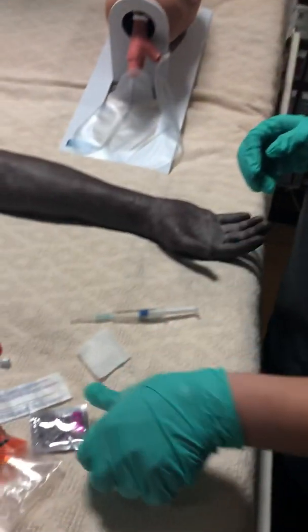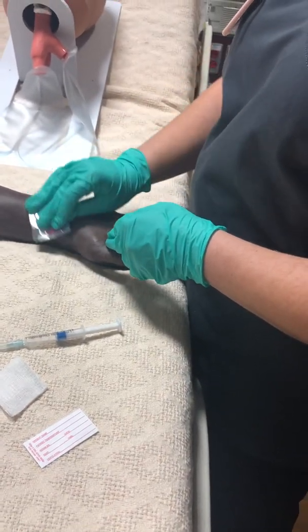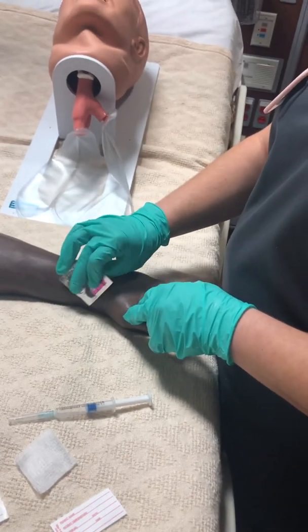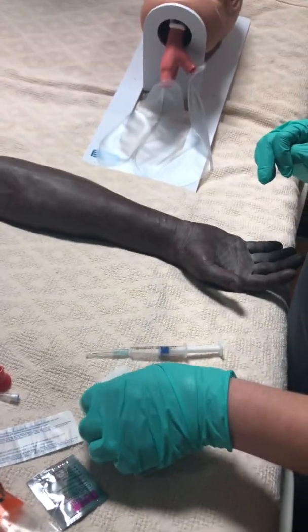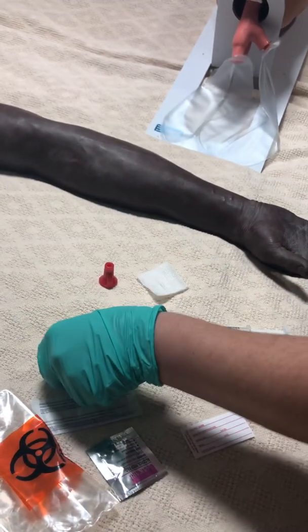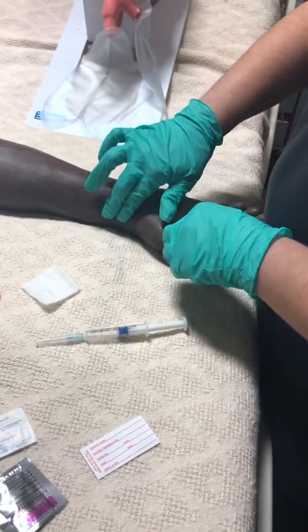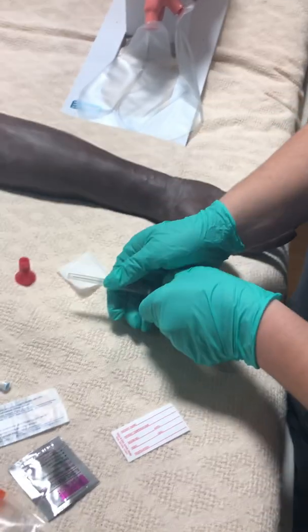When I'm ready, I take my alcohol prep wipe and wipe around where I'm going to puncture the site in a circular motion, because I don't want anything to get in, especially where we're drawing the artery. I always need to have my gauze with me, and my stopper for the needle, so that I don't puncture the patient or myself. When I'm ready, I palpate the radial artery to make sure I can find it again. Once I'm ready, I get my needle ready.